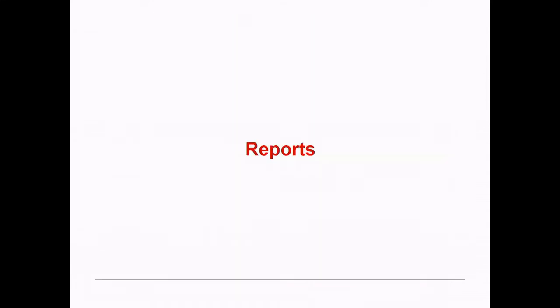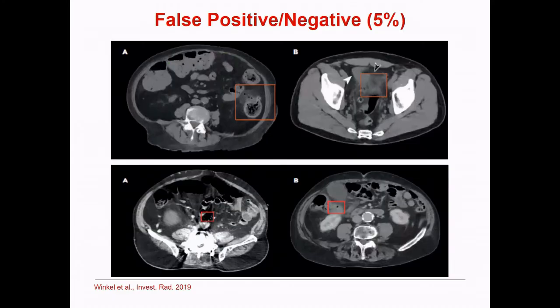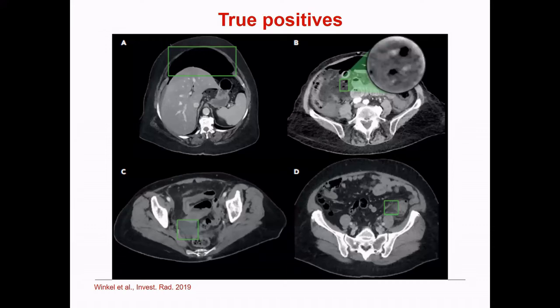So basically, oh, I'm sorry, that was the wrong one. This black stuff is air, and it shouldn't be in the belly as free air. So this is a big collection of free air that shouldn't be there. That's usually when the bowel gets perforated, air from the bowel gets into your belly, and this is a sign of acute abdomen.